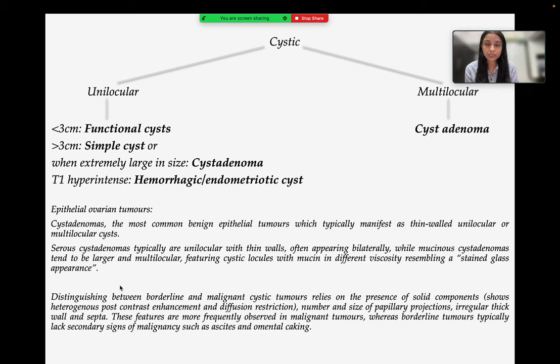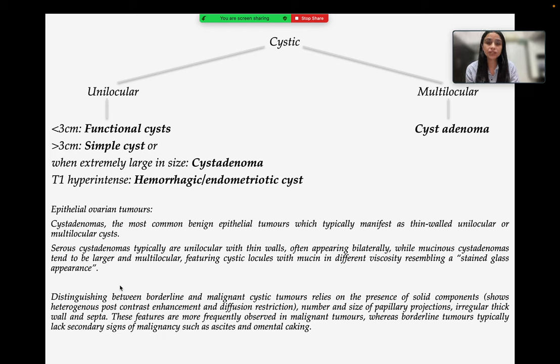Epithelial ovarian tumors are the most common, of which cyst adenomas are the most common benign epithelial tumors, typically manifesting as thin-walled unilocular or multilocular cysts. Serous cyst adenomas are typically unilocular with thin walls and often appear bilaterally, while mucinous cyst adenomas tend to be larger and multilocular with a stained glass appearance. Distinguishing borderline from malignant cystic tumors relies on the presence of solid components, irregular thick walls, and septae — features more frequent in malignant tumors — whereas borderline tumors typically lack secondary signs of malignancy such as ascites and omental caking.